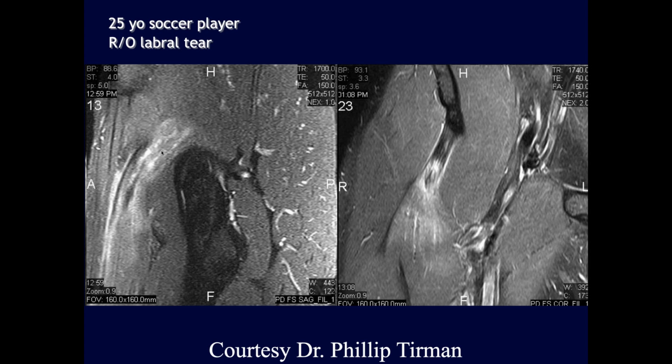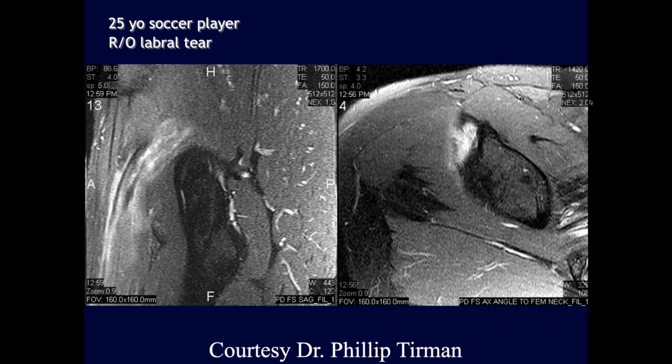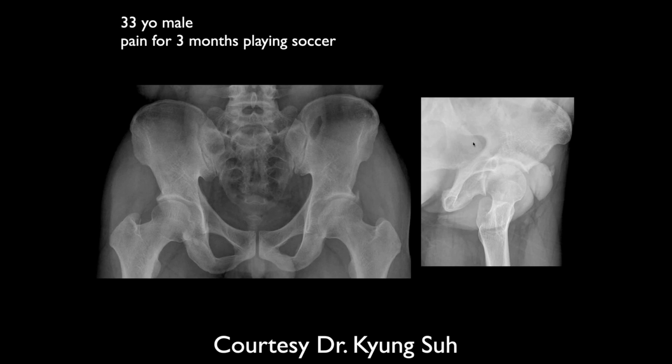It looks like there's at least strain, if not partial tearing, of this rectus. So this is really a grade 1 tear of the rectus femoris muscle, right up to the tendon, right along the musculotendinous junction there, and we can see the edema coming down through here. And so this was a partial tear of the indirect head of the tendon going around to the side insertion.